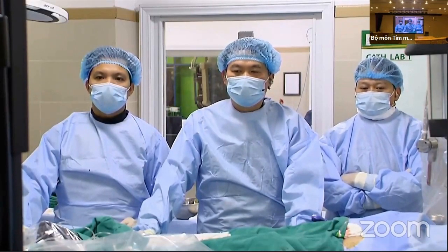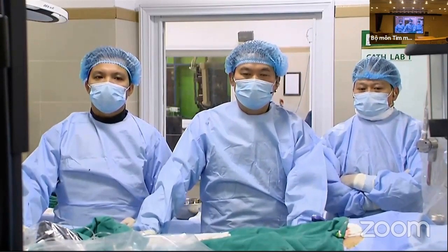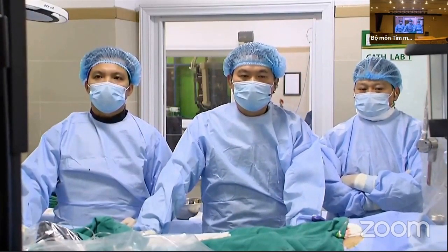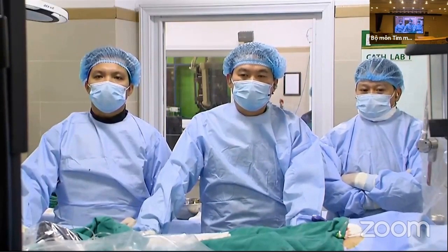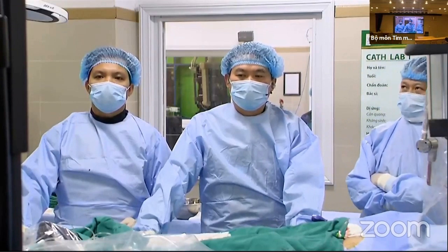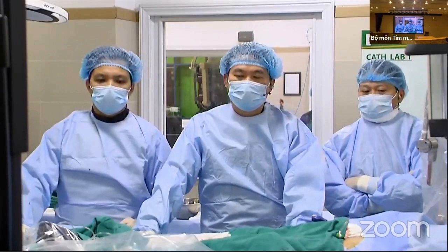I would also be very careful about where to end. I think the last 3 or 4 centimeters above the celiac is important, because otherwise the risk of spinal ischemia is much more. So I will probably end about 1.5 vertebra up from the celiac axis, just to prevent the risk.